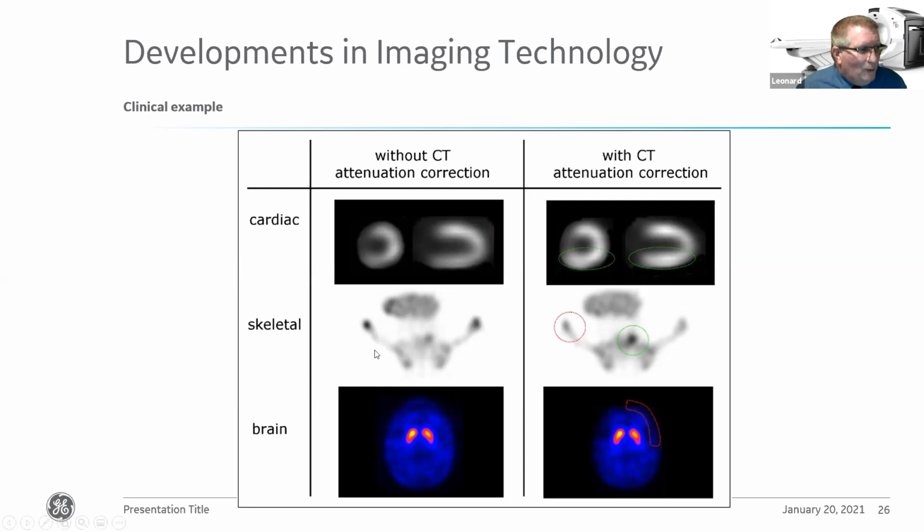The other thing is an example here to show you the inverse effect of that. This is without what we call the attenuation correction. You can see the hot areas at the end of the ileum as it's coming through. In this case, these photons at the end are not being attenuated at all and are coming straight out, whereas some of the other photons coming from elsewhere within the pelvic area are being attenuated. So it makes it look like it's hot at the ends of the ileum, when in actuality it's not. When we then review, we see that this uptake area, which has been attenuated, now does become hot and is something of interest, where the uptake at the ends is not of interest at all. So it allows us to differentiate that a lot easier.